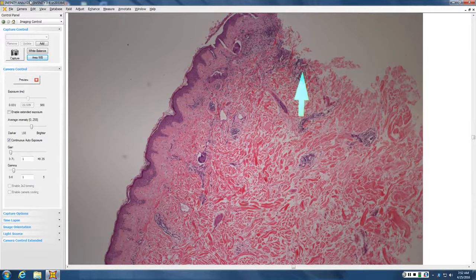If you biopsy and see only this, only dilated lymphatics, cut deeper sections to exhaust the block. If you don't find the tumor, biopsy again, because the likelihood is it's there. And she needs to know so she can get going with treatment. So, young woman, post-mastectomy, reddish, pinkish skin, just sort of subtly inflammatory looking clinically.